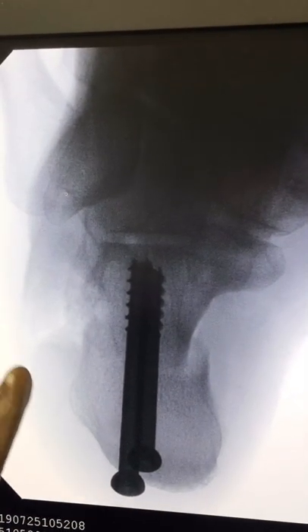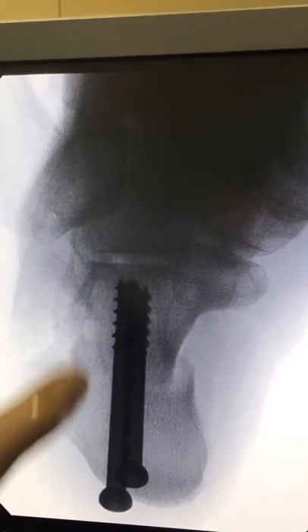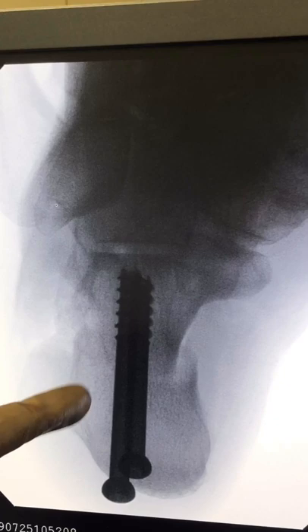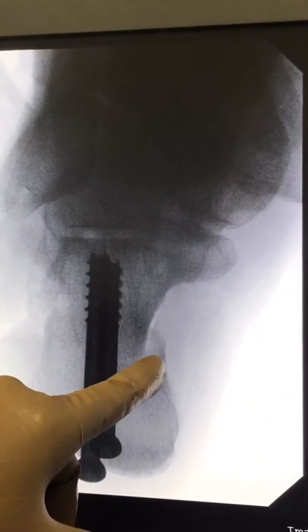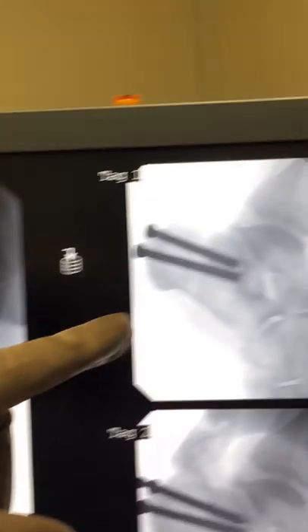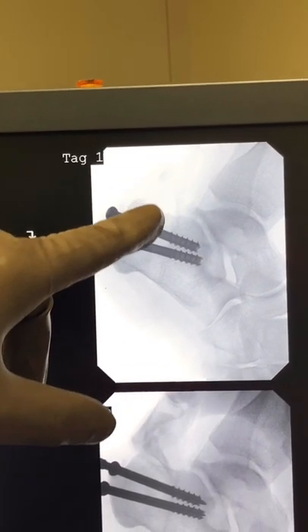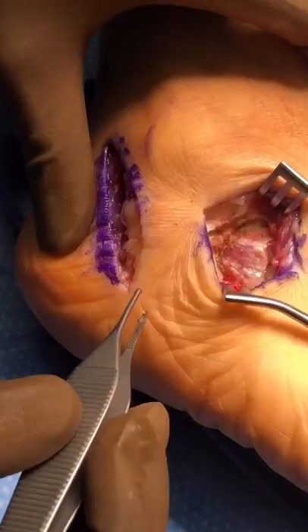Here you can see what we call an axial view of the calcaneus, or heel bone, in near-full alignment vertically. You can see the two screws holding the osteotomy — the cut part of the bone — and how it has shifted over about a centimeter, which is what we're aiming for. Here you can also see the side view of the cut and the two screws we placed to hold it.